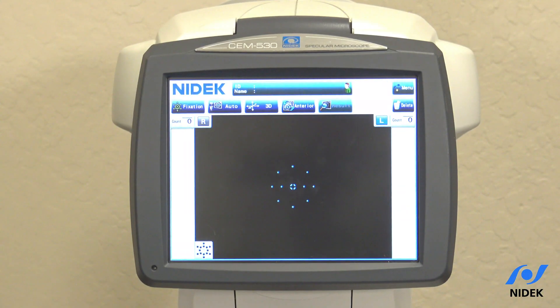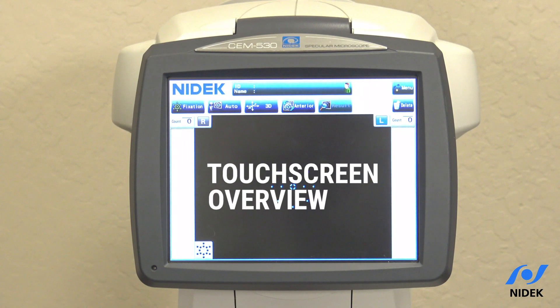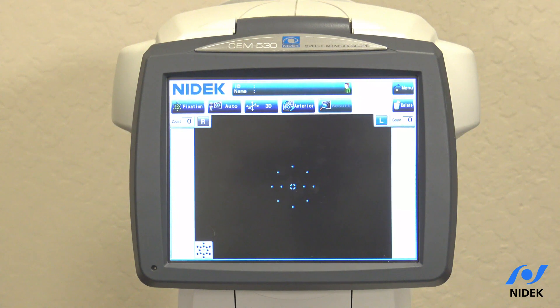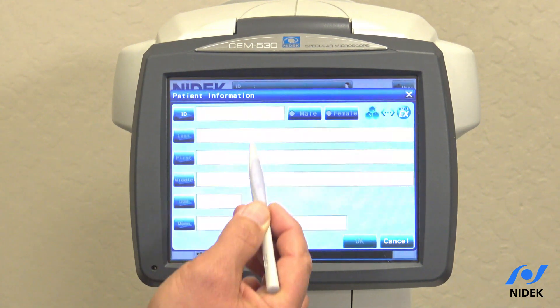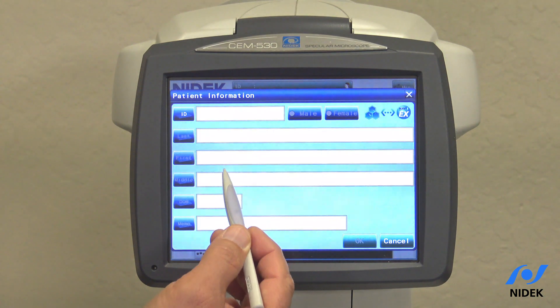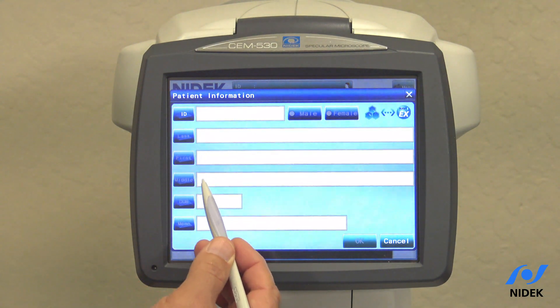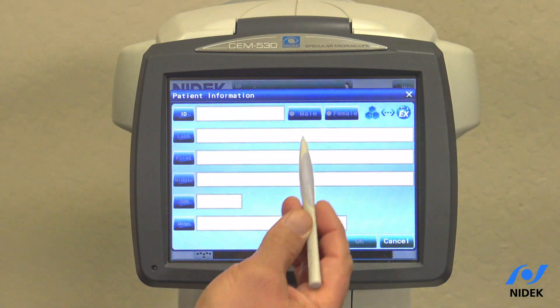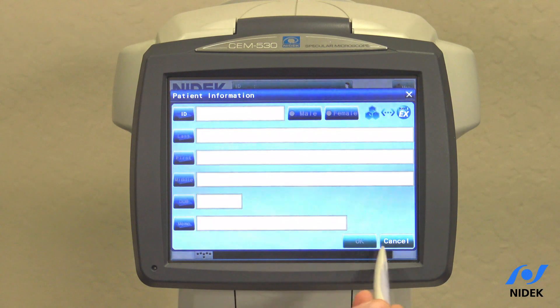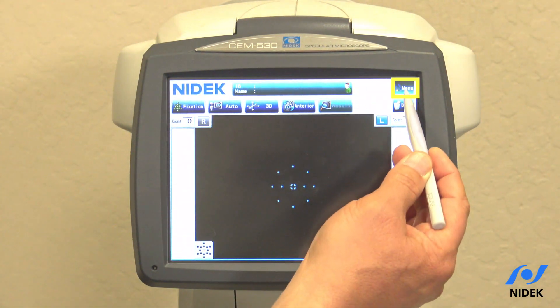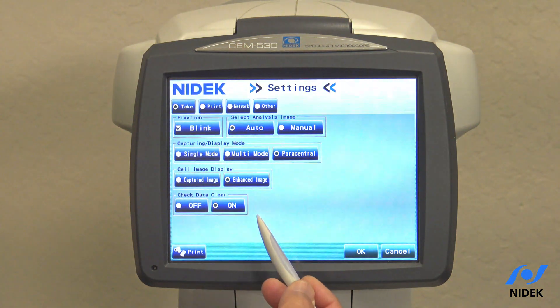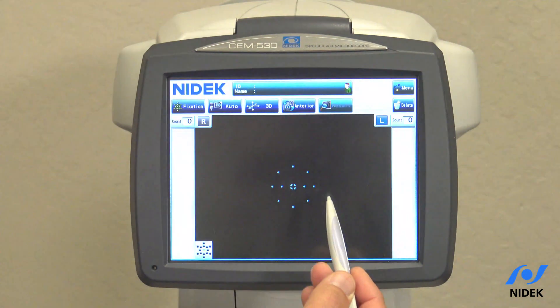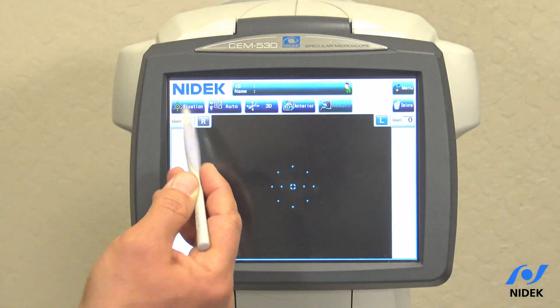Now I'm going to provide an overview of the touch screen on the CEM530 Specular Microscope. Select here to enter the patient's ID, last name, first name, middle, date of birth, memo, and gender. There is also a menu tab for your settings and fixation points.